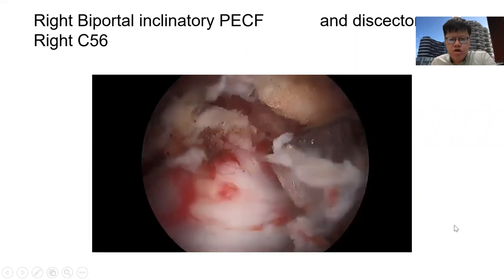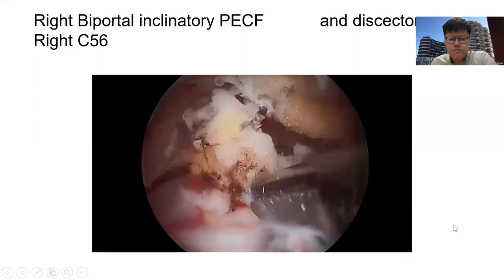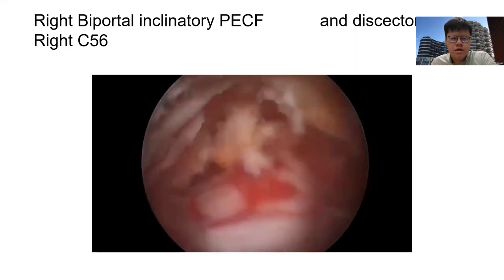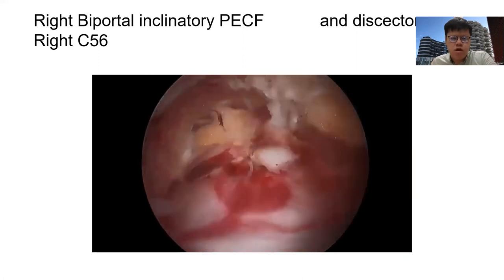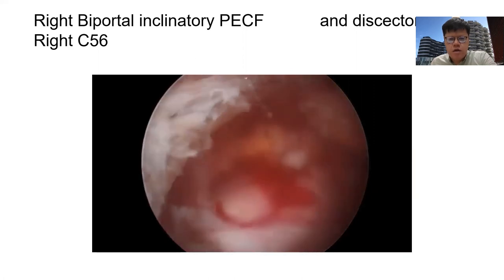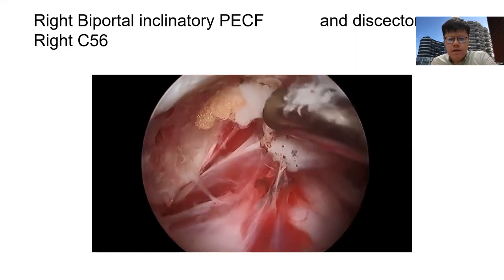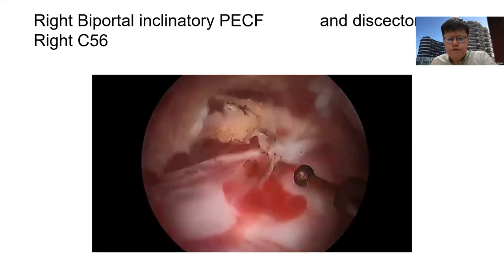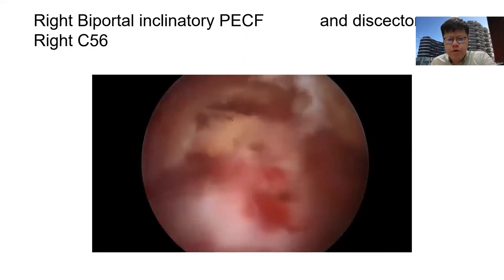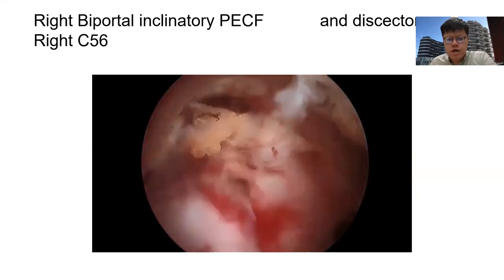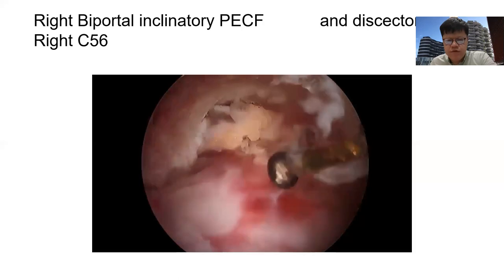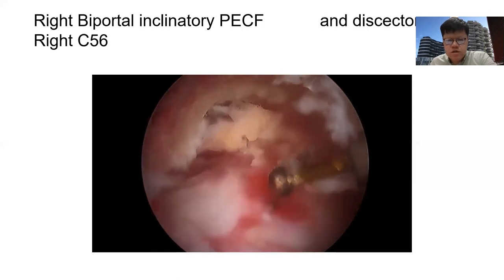From the visualization, we are standing on the contralateral side, decompressing the contralateral foramen — I'm standing on the left, decompressing right C5-6. As you can see from the video, you can explore the spinal cord and the exiting nerve root is visualized in a very nice manner by biportal. Biportal comes from two different ports, so the working cannula and the viewing cannula are from different ports, and hence there's freedom of movement of the working instruments.